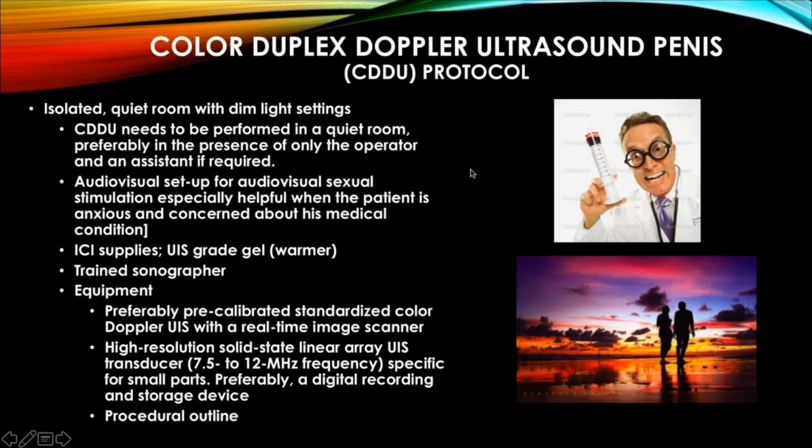Again, they should be prepared when they get there. They should know they're going to get an injection in the penis. Many times it's important, if you don't have materials to cause sexual stimulation, that you advise patients to bring phones, iPads, or some other thing that they can look at sexually stimulating videos and the like. Sexual stimulation, these tests are difficult.